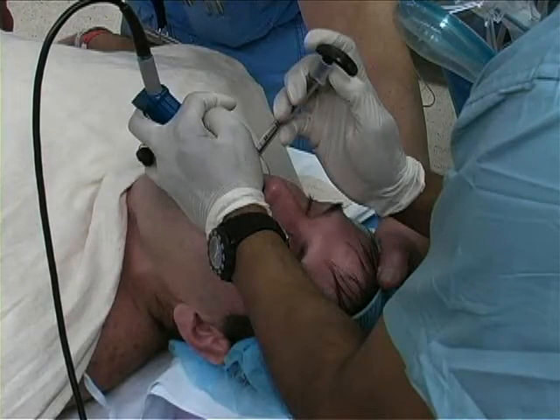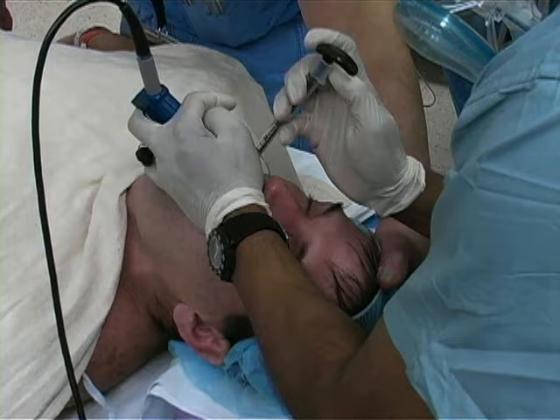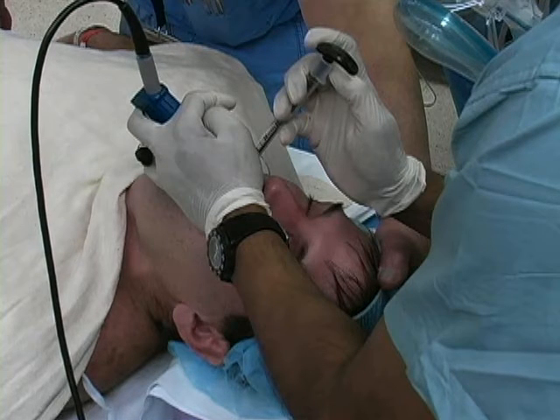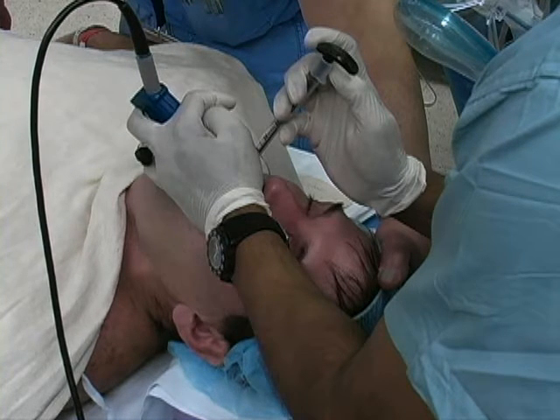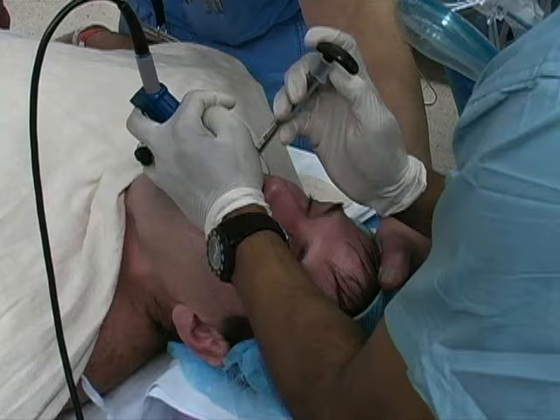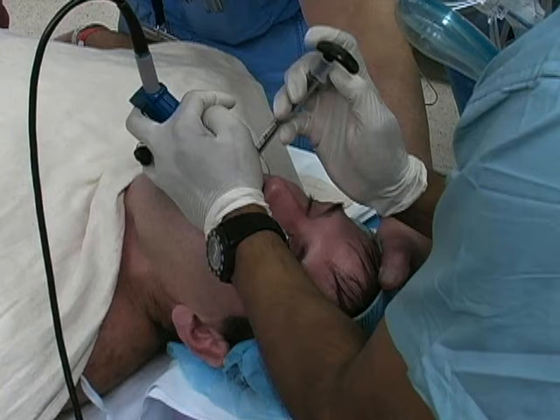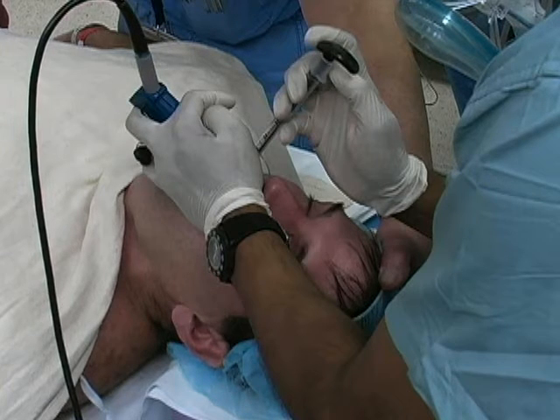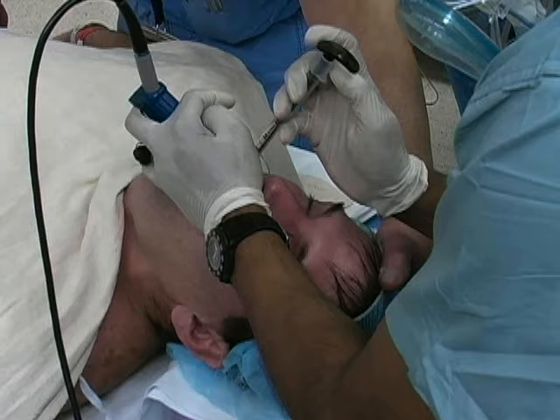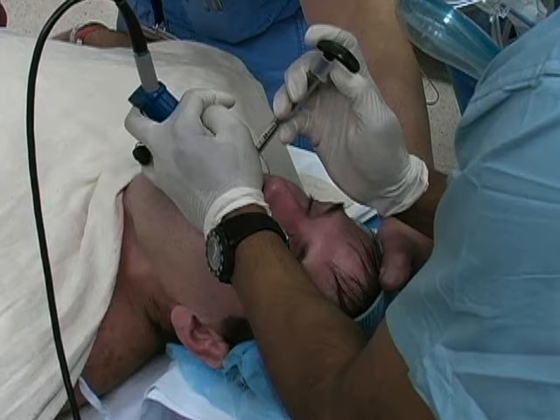The GlideScope is designed to provide a view of the anterior glottis without a direct line of sight, and is therefore used to endotracheally intubate patients whose laryngeal and vocal cord view is challenging by traditional methods.